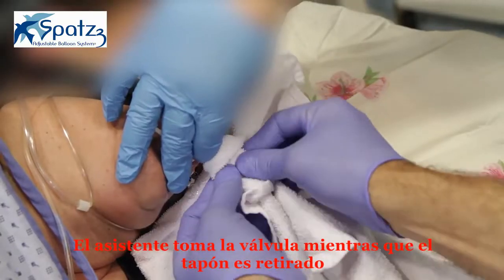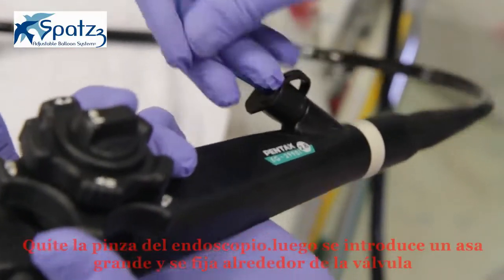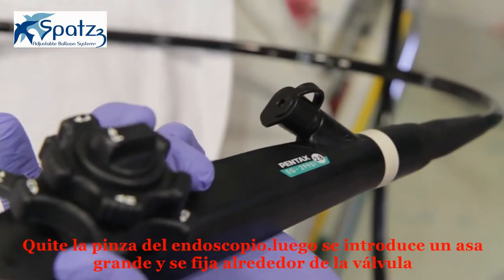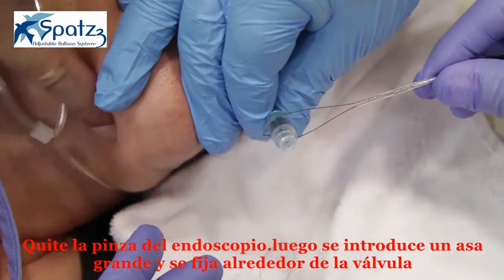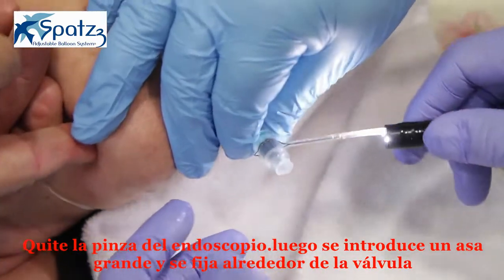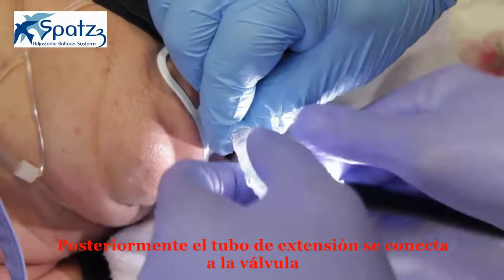The valve is grabbed by the assistant while the cap is removed. Remove the grasper from the scope. Then, a large snare is inserted into the scope and is tightened around the valve. Next, the extension tube is connected to the valve.